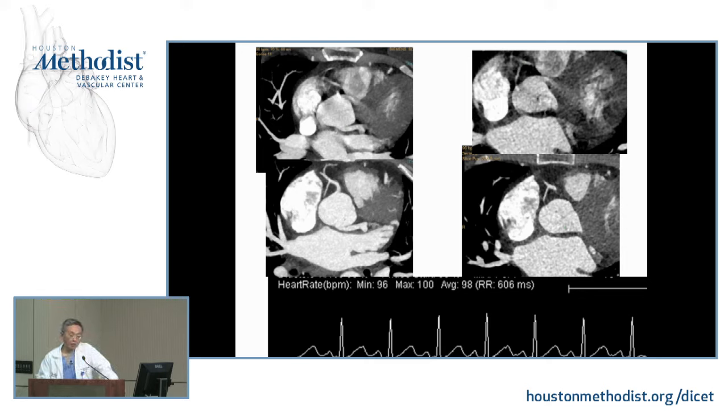So in the old scanner, I would say we'll probably never be able to do prospective gating, because the chance of finding one single moment in the cardiac cycle to have all the coronary segments perfectly frozen is almost impossible. Okay, so in a newer scanner, we could use, for instance, prospective gating, again, doing systole or doing diastole. As you can see here, very different. The top panel, the lower panel, and the middle panel correspond to a different part of the cardiac cycle. One is completely uninterpretable, and the other part is perfectly interpretable, okay?